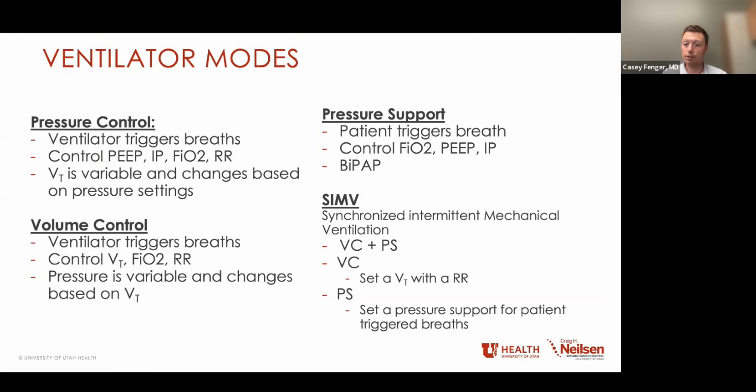Then you also set to pressure support. And so if a patient tries to breathe outside of the set respiratory rate, or is triggering their own breaths, then the ventilator is going to give them some pressure to help support that breath.